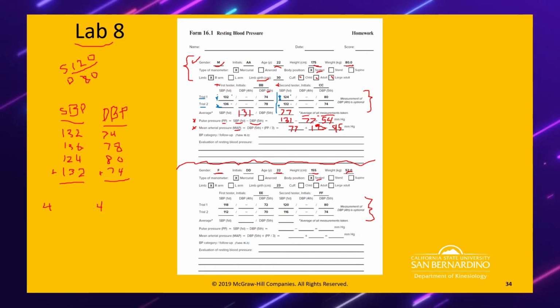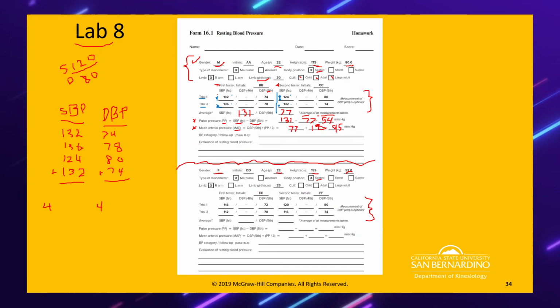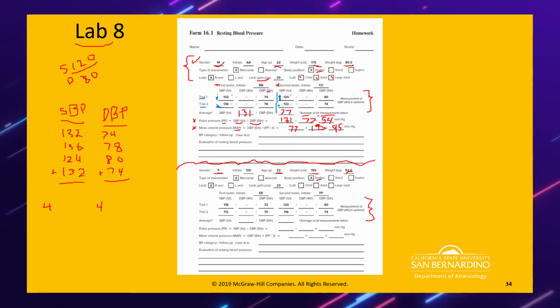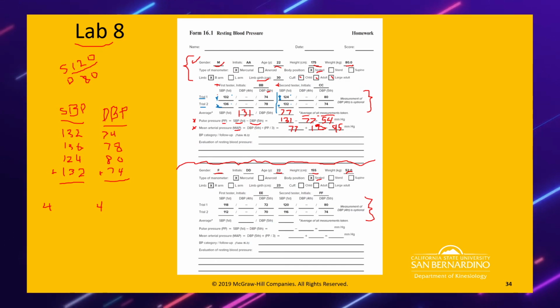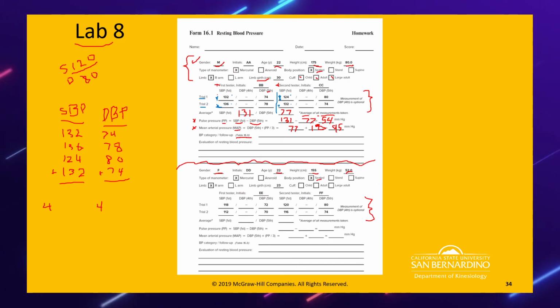Being that this is such a simple lab, I'm just going to walk through it with you guys to this point. The rest of it is going to be you guys as a clinician categorizing this with their blood pressure category on table 16.3, as well as the evaluation.